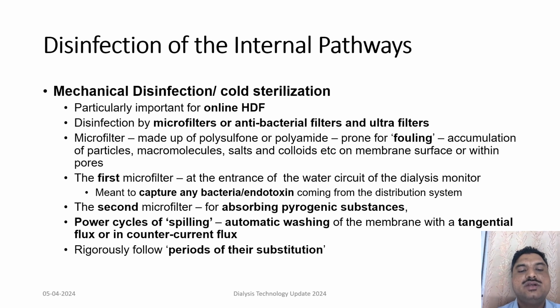A method called power cycles of spilling, where automatic washing of this membrane can be done with the tangential flux or in counter current flux of the dialysis water. However, one must remember that these filters remain active only for a short period of time, so one must follow rigorously the periods of their substitution for their efficient action.